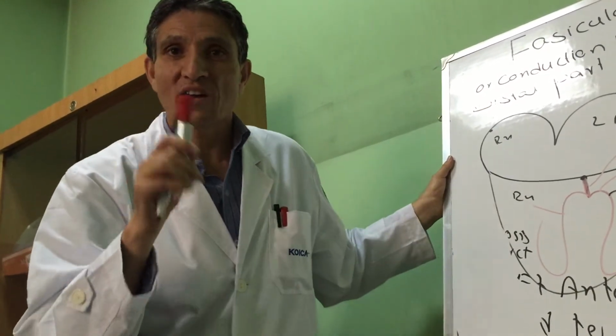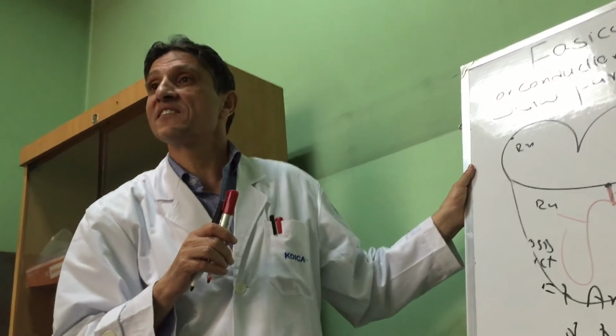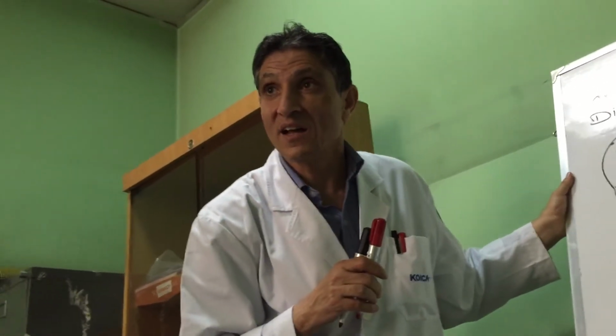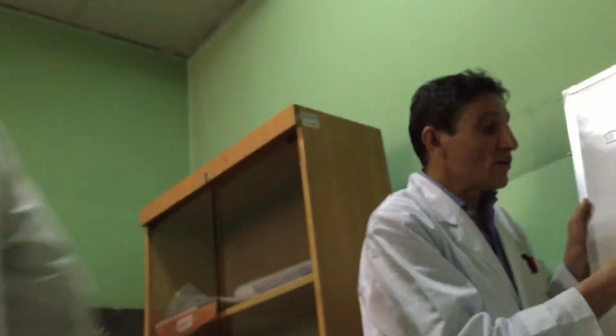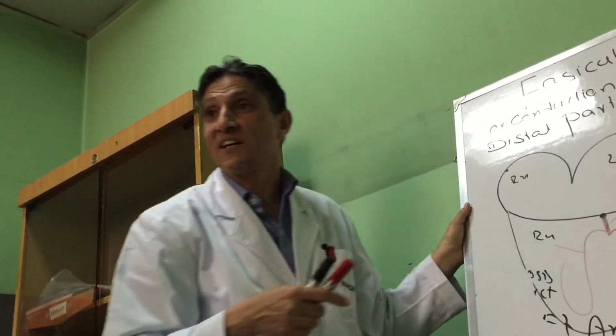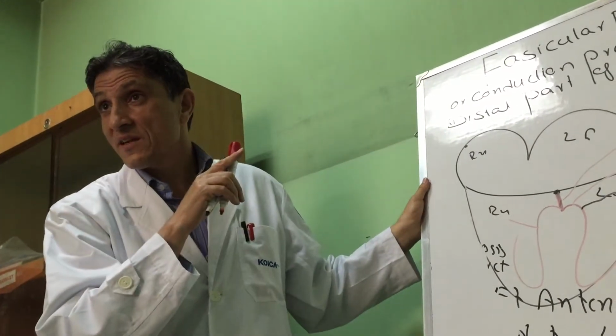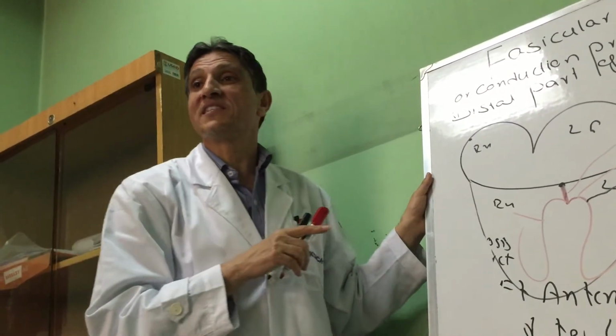One of the most common causes of left axis deviation is left anterior fascicular block. If a patient has left anterior fascicular block, the left ventricle has to be depolarized by the posterior fascicle, so the axis is rotating upward.